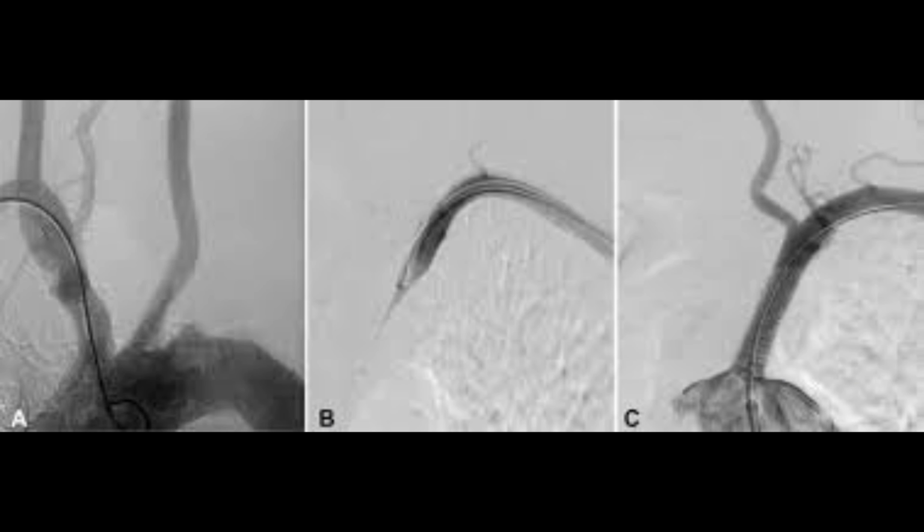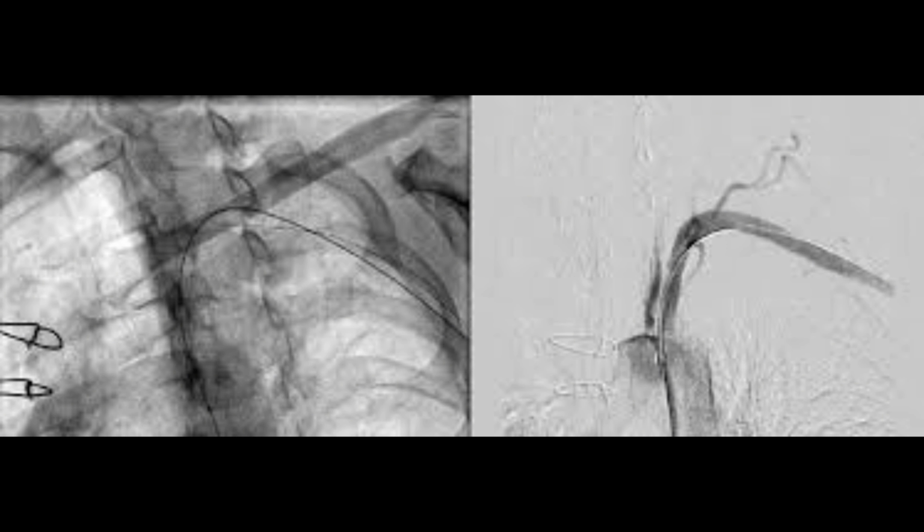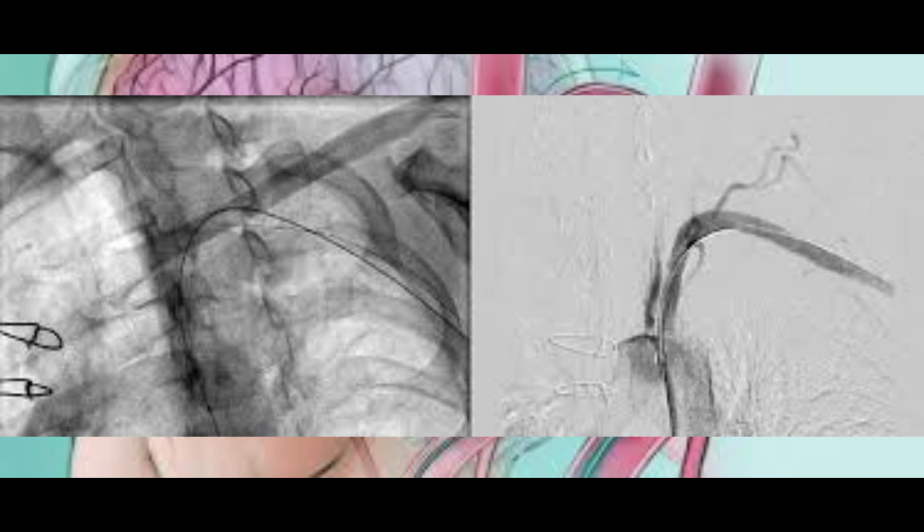In summary, subclavian steal syndrome is a condition where a blockage in the subclavian artery causes abnormal blood flow, leading to decreased cerebral perfusion and potential neurological symptoms. It is often revealed during a cerebral angiogram when abnormal flow patterns in the vertebral arteries are observed.